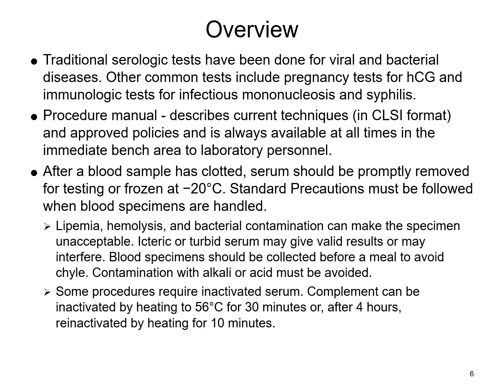Now, as we previously discussed in the intro, each laboratory is required to have procedure manuals with very detailed and specific procedures within them. The laboratory can use package inserts as a reference, but they cannot use them as a standalone procedure. Procedures must include certain details, and they must comply with the Clinical Laboratory Standards Institute format.